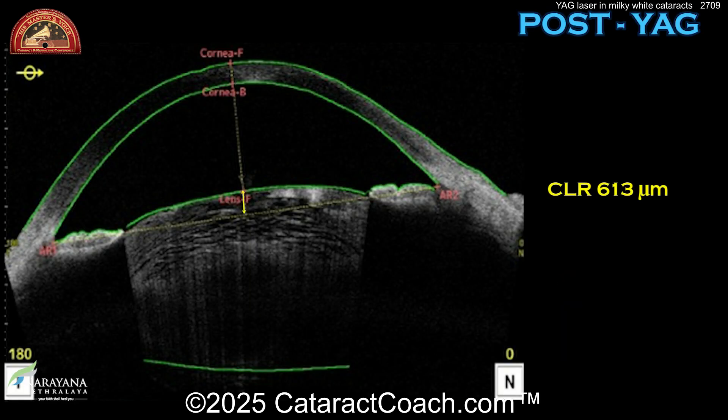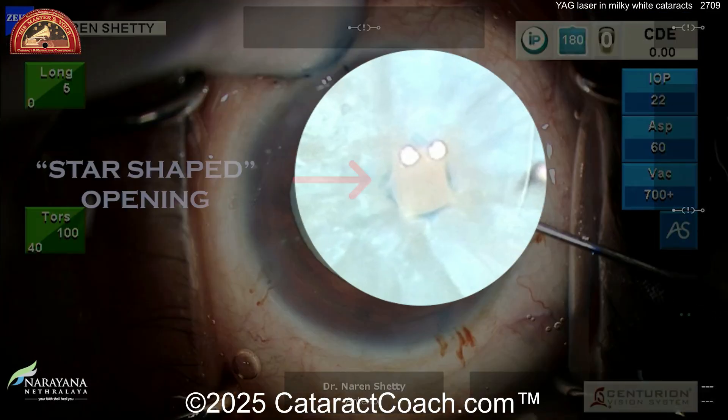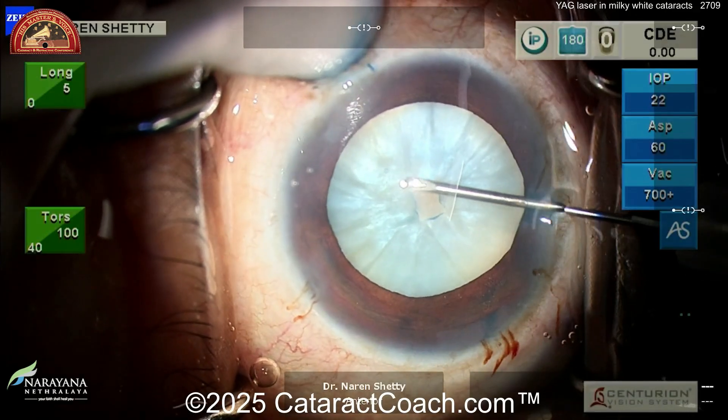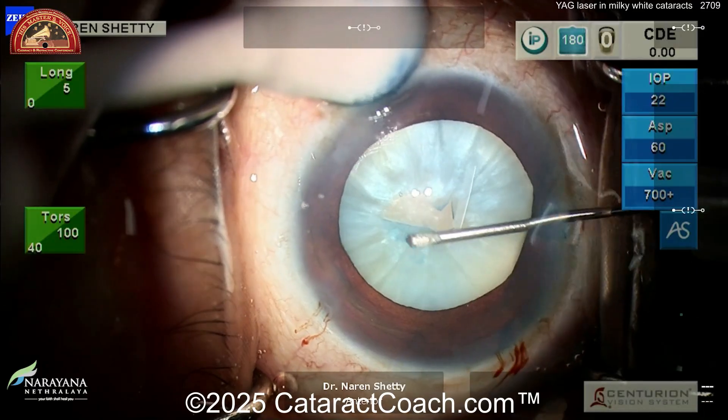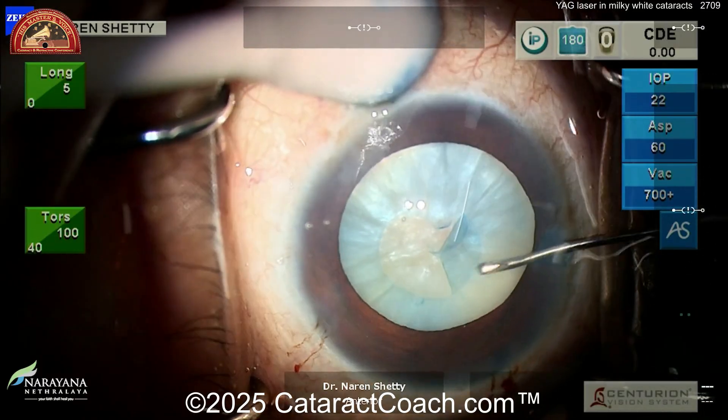Now look — you've got a deepened anterior chamber, and the CLR is only 613 microns, so half of what it was before. There's the star-shaped opening from that one shot of the YAG laser. Now the bag is decompressed, easy enough to just get your REXs done, and the risk of runout is very low now.